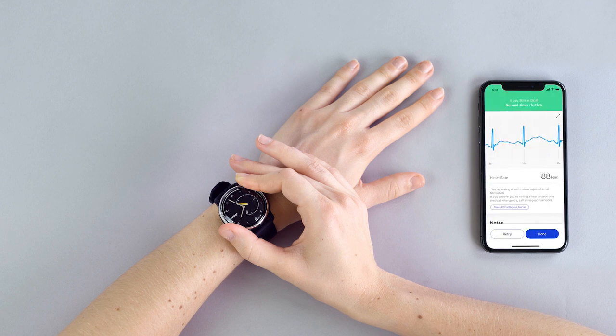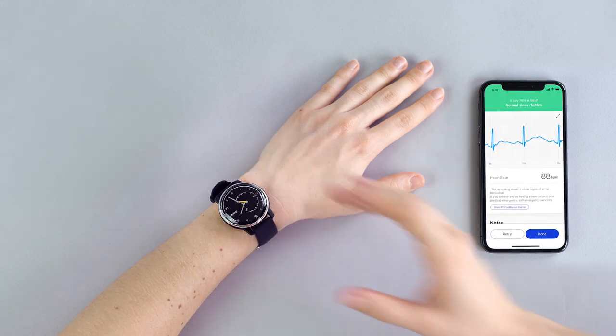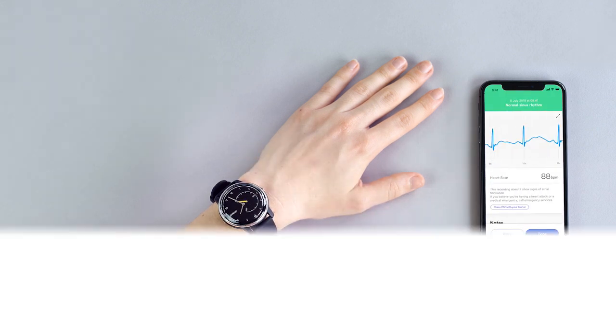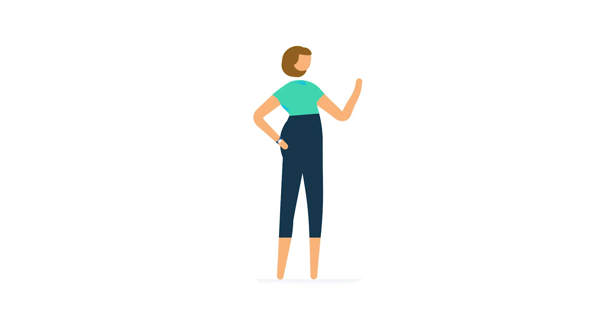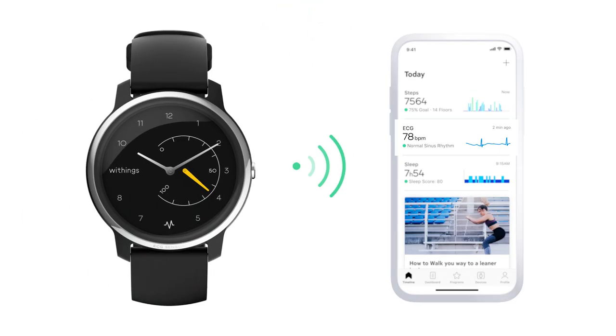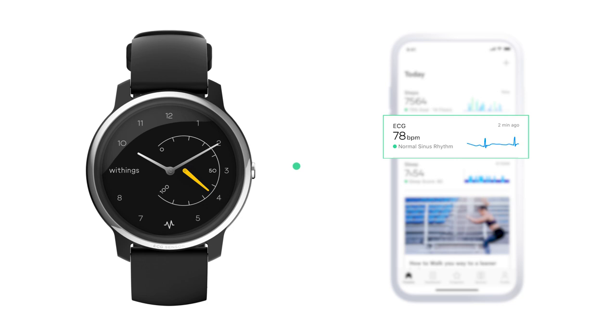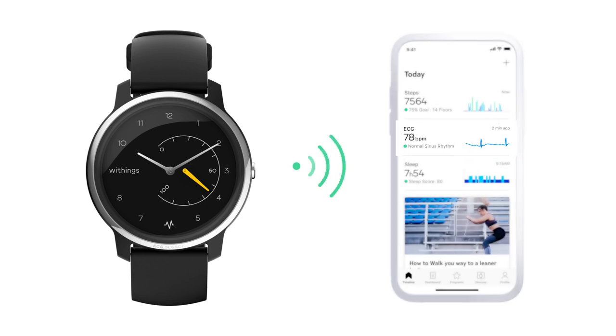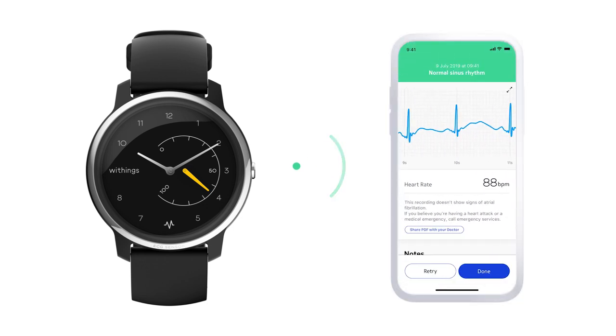After 30 seconds, you will have the result. If you don't have your phone with you, you can still record an ECG on the go with the same gesture. The ECG module will show your results the next time you open the HealthMate app to sync your watch.